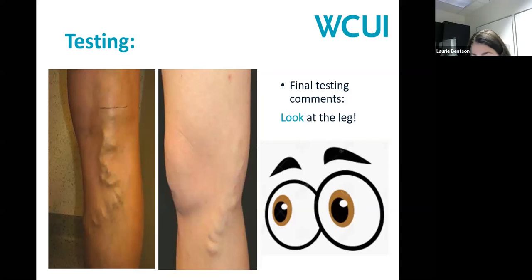And when we look there and the patient shows us what's bothering them, we see a large varicosity, and we assess it and follow it and determine where it goes. But if we wouldn't have looked or asked, we would have missed it because it was on the lateral leg, and we are not scanning the lateral leg. We scan from the medial and anterior approach typically. So it's really important that we are talking to our patients and asking them where it hurts, look at their veins, look at the ulcers. And we're fortunate because we can move our probe, our camera, wherever it needs to go.